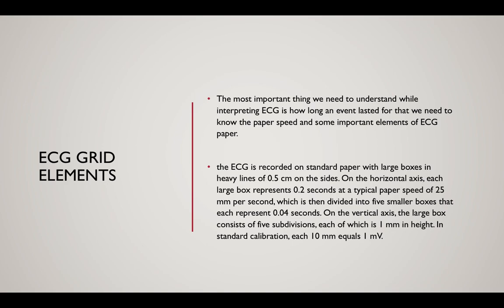On the graph paper of an electrocardiograph, to be very specific, it consists of larger boxes and very small boxes. I'll show you a picture of one of these graphs.